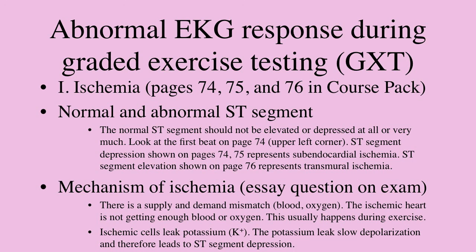And so you can track the tests at 2 minutes, 4 minutes, 6 minutes, 8, and so on. And some of this actually goes into recovery too. But what we're seeing here is the ST segment depression shown on this, and there's other examples in a few minutes, represents subendocardial ischemia. So lack of oxygen, ischemia is lack of oxygen to the inner layer of the heart, referred to as the subendocardium, or sometimes the endocardium.